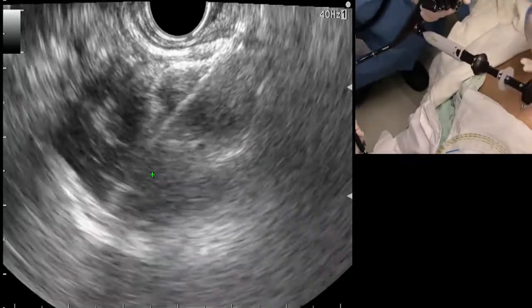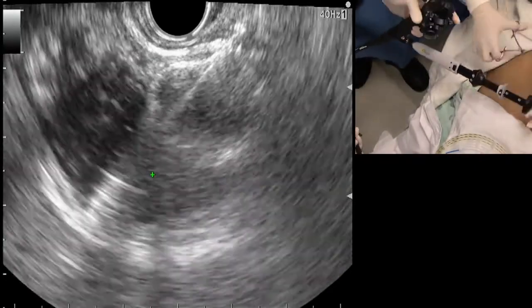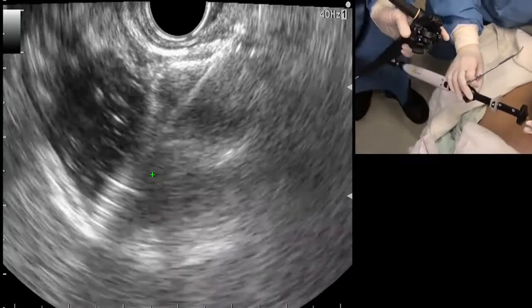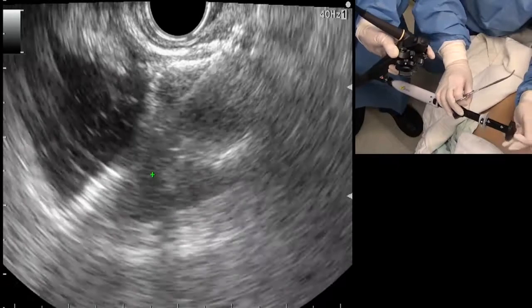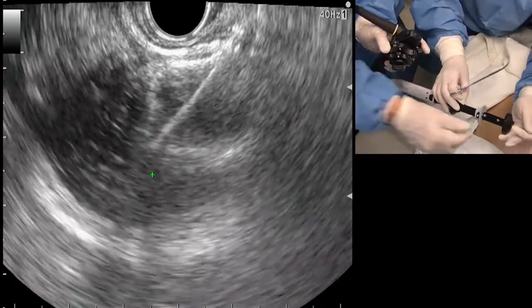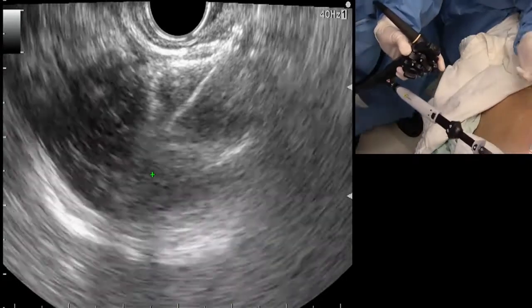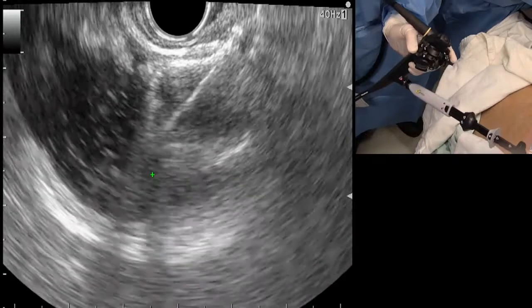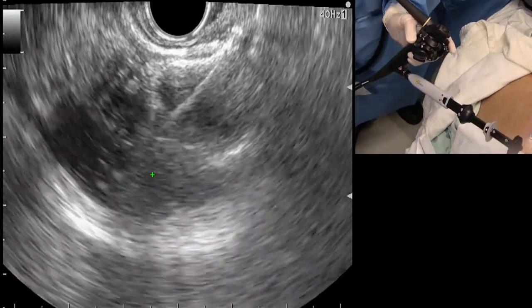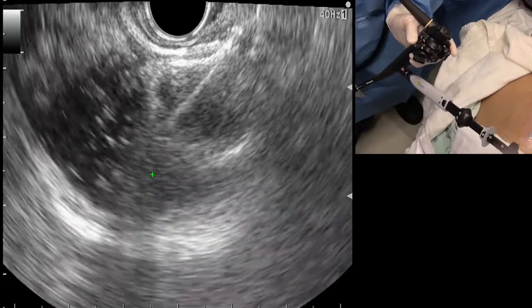All right. Now, this is the step where you could advance your wire in a little bit as a safety net. So the wire's up here, and we'll let the nurse kind of do that. Sometimes you'll see the wire going in. Sometimes you won't. But don't push against resistance, because you could actually push the wire away. But it's just in a little bit so that if anything were to happen, the unexpected, right, then we've got a safety plan B.